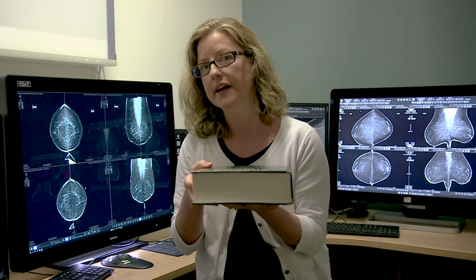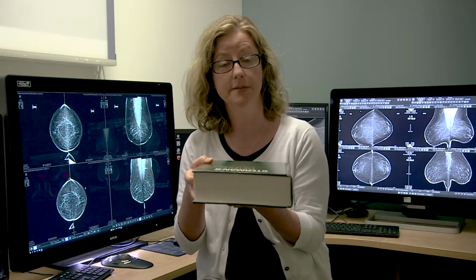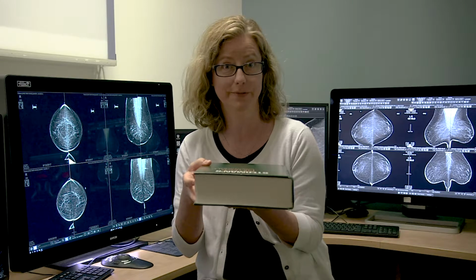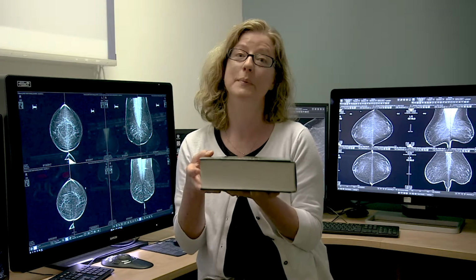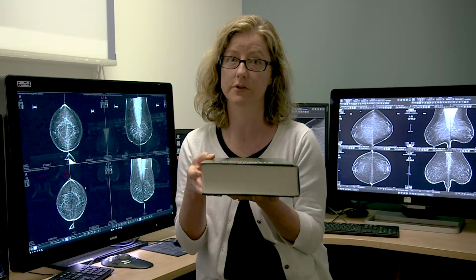Let's then imagine that you're the doctor looking at this picture with all of the overlapping words from this book, and there's only one word you're trying to find: cancer. The word might be in the book or it might not. Hopefully not. But if it is, you need to find it. On that one picture, it would be very hard to see the word you're looking for.